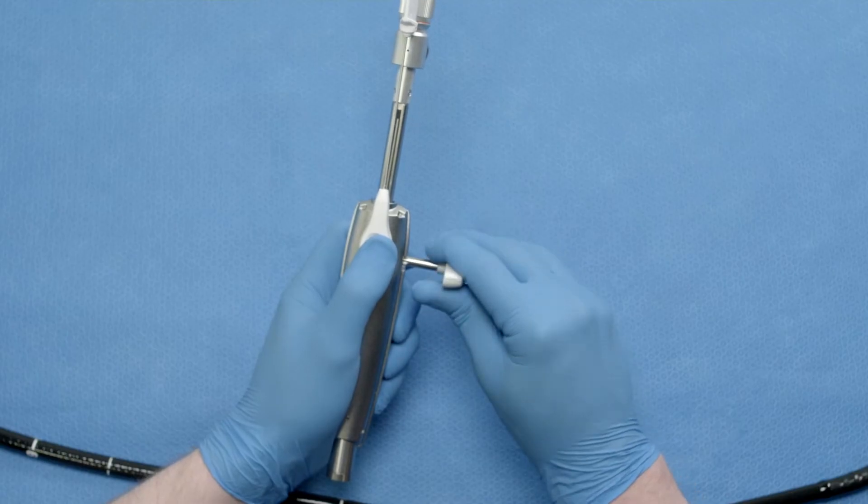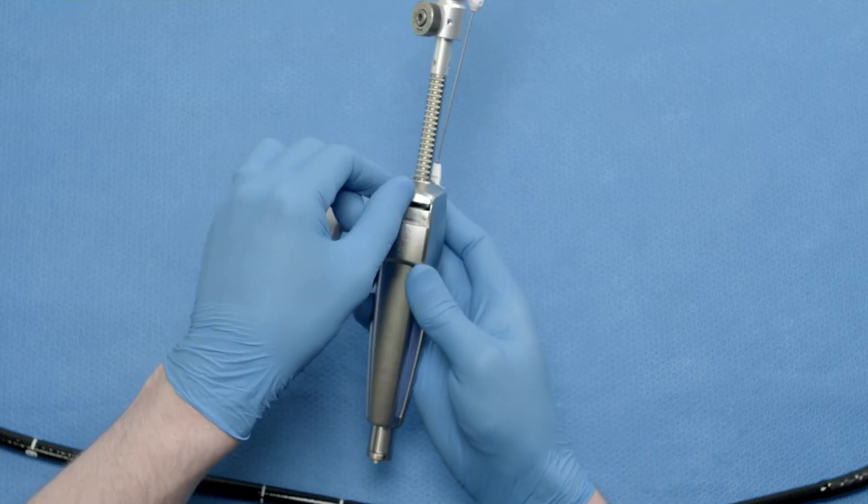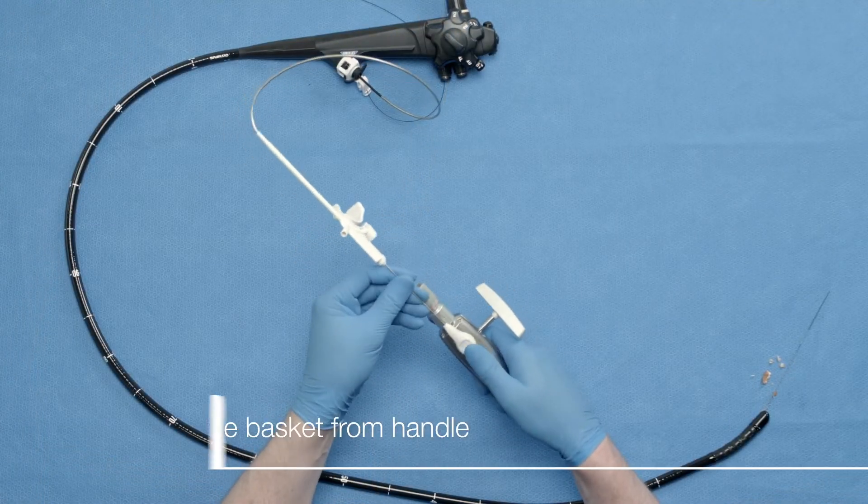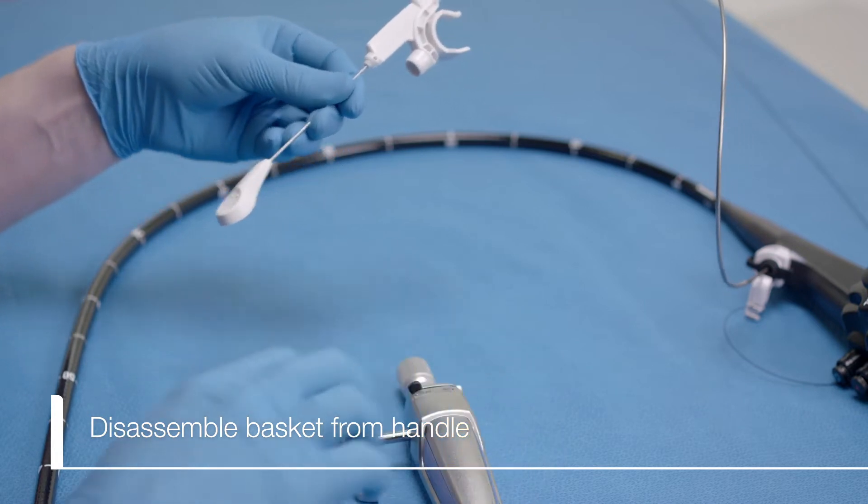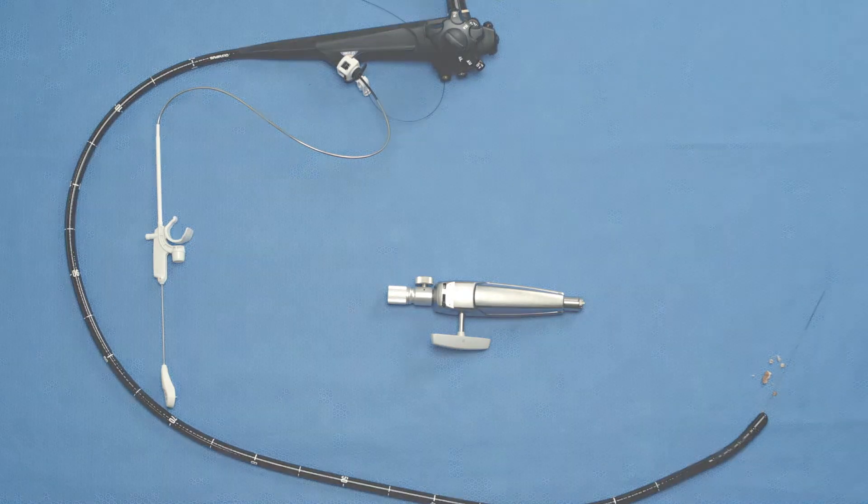When either the stone fragments or the basket breaks, turn the ratchet off and fully close the basket, then remove the basket from the patient. Disassemble the VortiCatch V Basket from the Lithocrush V Handle by reversing the assembly steps. Dispose of the VortiCatch V Basket when the procedure is finished.